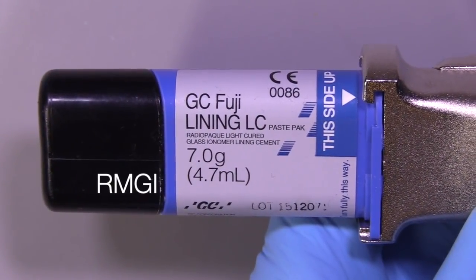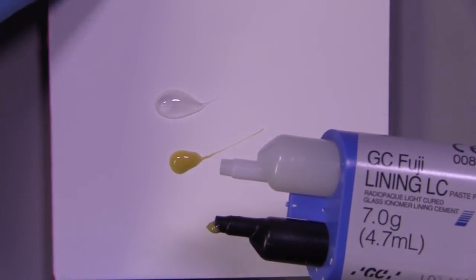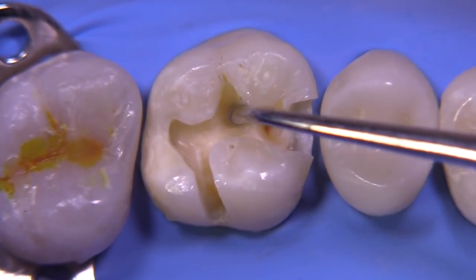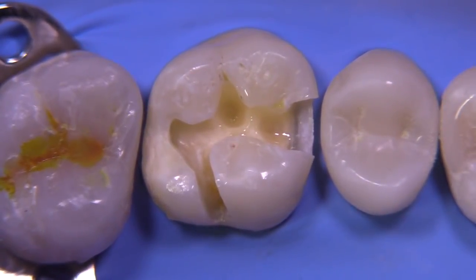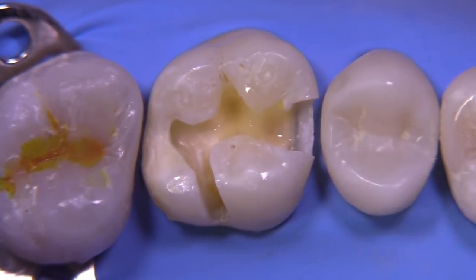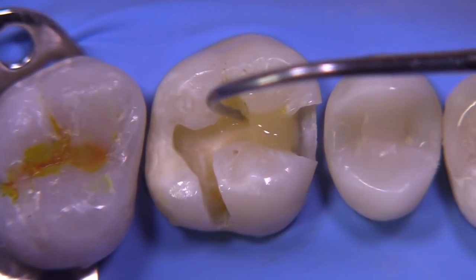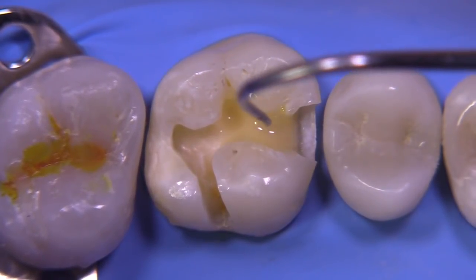I'm going to utilize a resin modified glass ionomer liner. This little system can be dispensed by clicking the lever on the back and you get both the base and the catalyst. I always like to make sure I recap this so that the material stays uncured. We'll scoop up a little piece — you can either use a Dical calcium hydroxide type mixing applicator or Birtle's applicator, which is my preferred method. Today I'm using a small plastic instrument used for composites. We can usually keep it a little bit neater and not let it flop all over the finish line and the margins.